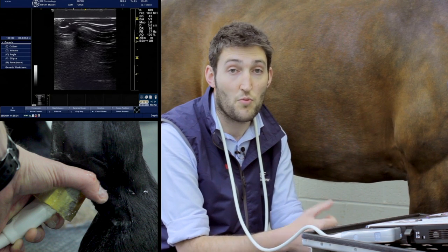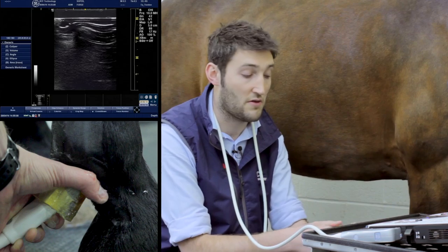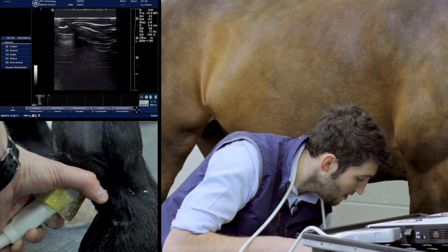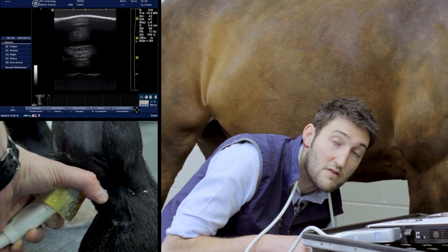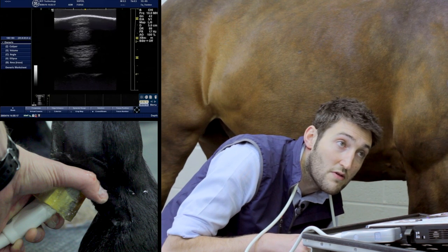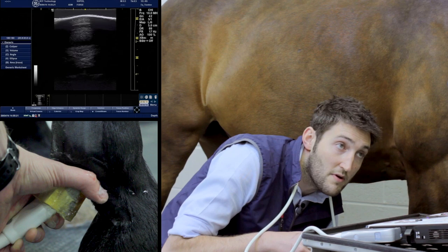So we'll start at zone 1A, and as before, we'll get the image, freeze, and then we can discuss the structures. We're starting just distal to the ergot, about one to three centimetres distal to the ergot on the midline, and we're just going to try to optimise our image.